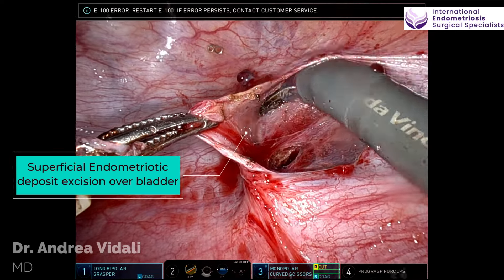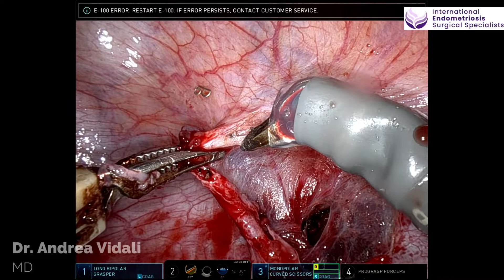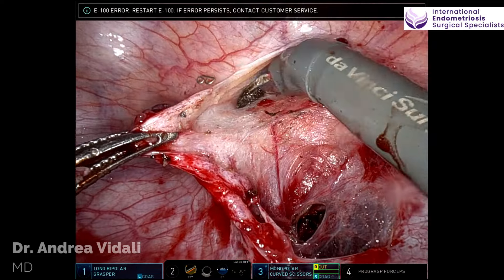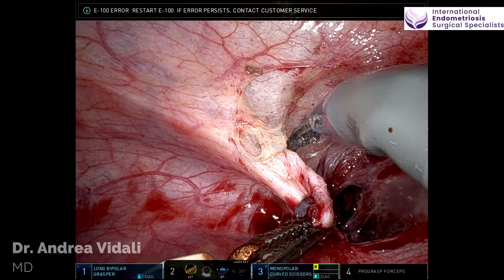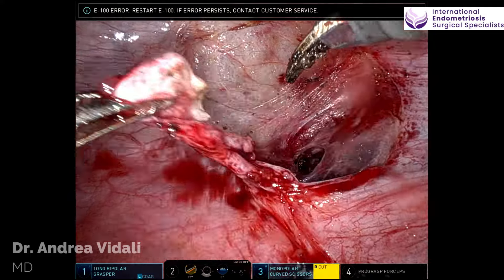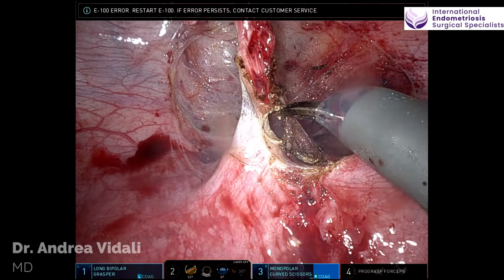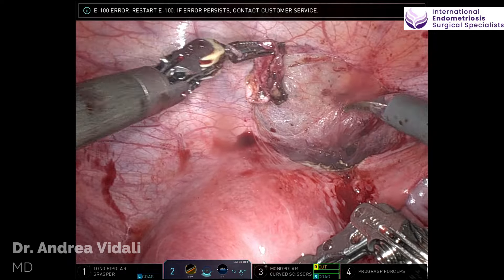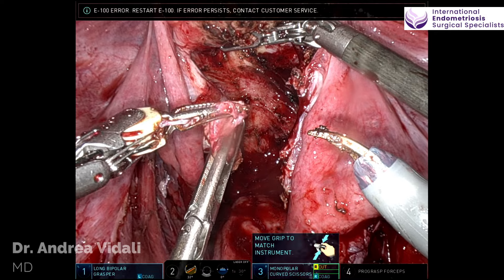This doesn't dig all the way down to the bladder, but some of these superficial lesions can cause some degree of bladder irritation. That staple you see there is from a prior appendectomy that the patient had, which was responsible for identifying the patient's endometriosis. Most likely, the endometriosis was the reason why she went to the hospital to begin with, and she ended up with the appendectomy.